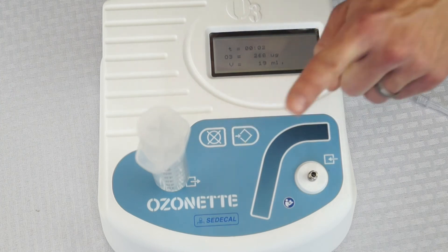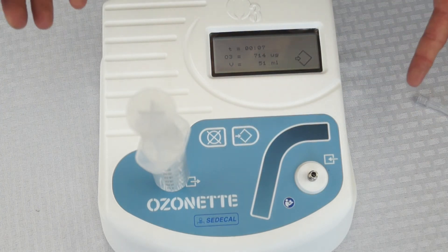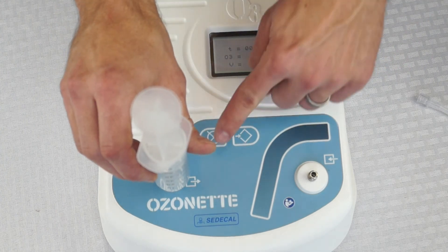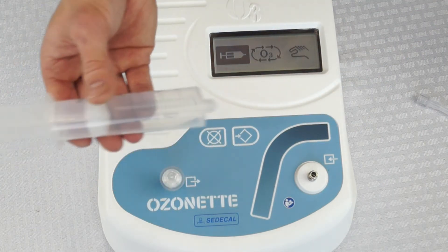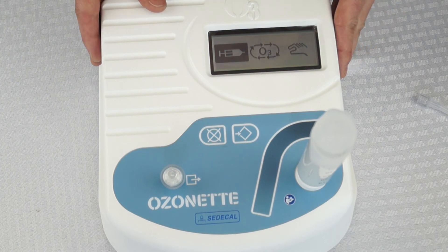Whenever you let go, it stops. You can stop and start as much as you want. When done, it will give you the amount of ozone in micrograms, your total volume, and the amount of time that ozone was produced. Remove your syringe and use the destruct port to dispose of any remaining ozone. That is all there is to using and operating the Ozonette.